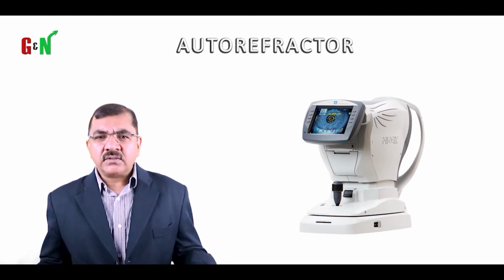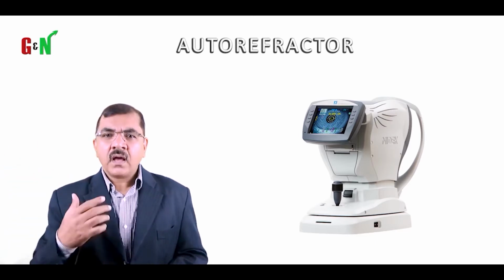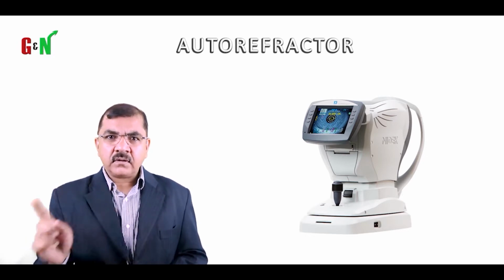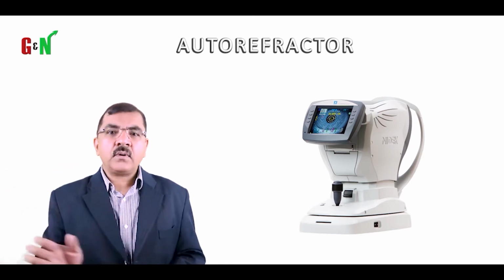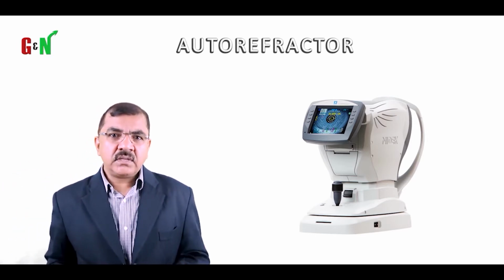It does refraction, as the name suggests. It is automatic. You put the patient behind the autorefractor, ask them to see the balloon inside the lens, you just press the button, and for left and right eye you immediately get the power. Except for reading power, the distance power is definitely detected immediately.